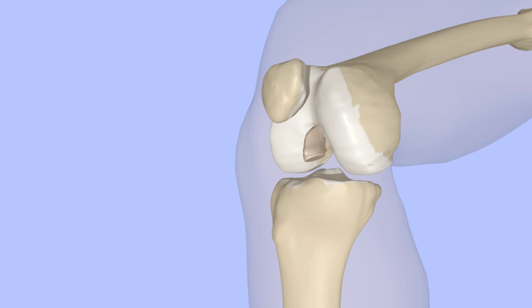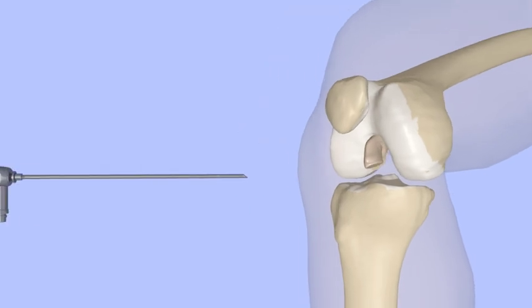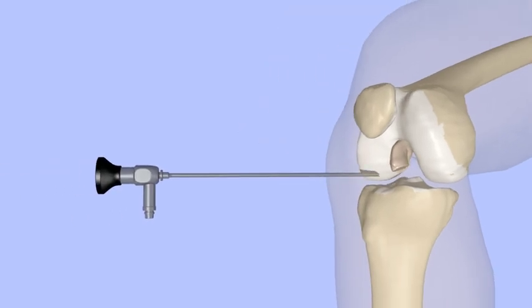ACL reconstruction is done arthroscopically. This means that rather than making a large incision to expose the joint, small incisions are made, just large enough to pass a small camera and instruments into the knee. Sterile water is used to provide pressure in the knee and allows the surgeon to see with a scope.